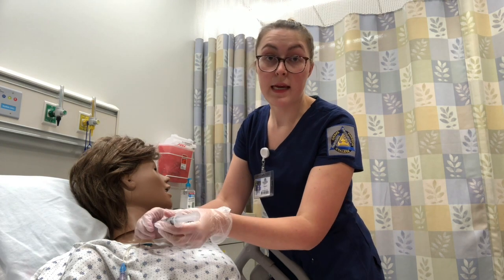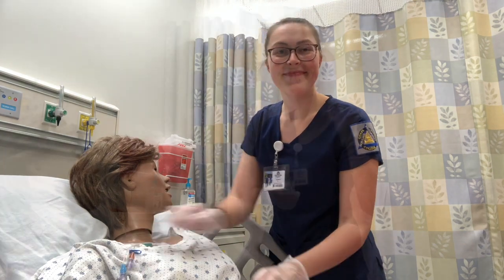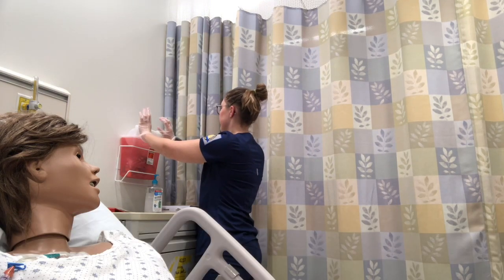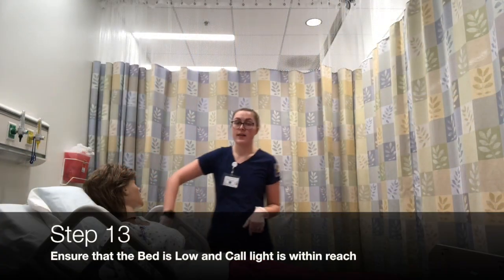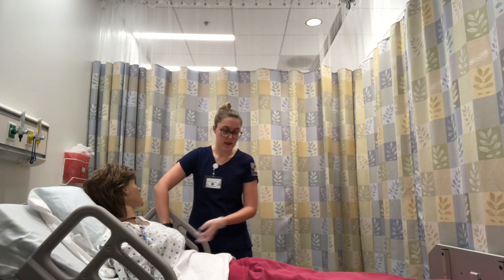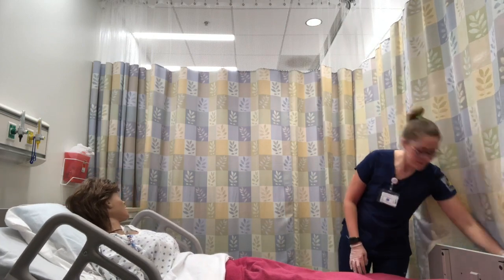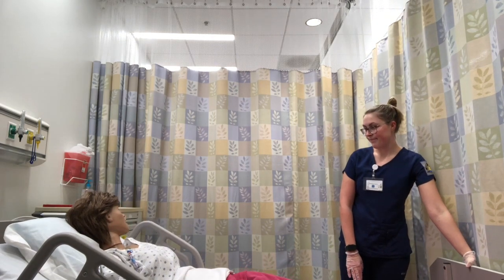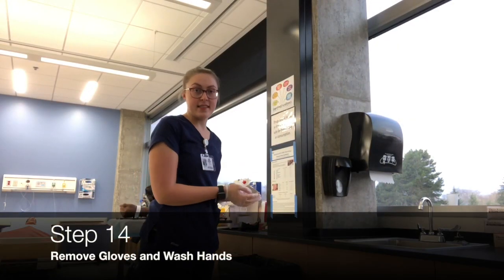After I've flushed, I will reclamp the site. I'll dispose of my syringes in the proper site. I will then ensure that my patient's bed is in lowest position and that her call light is within reach. So the call light's over here, and I will lower the bed. I'll then remove my gloves and wash my hands at the sink.